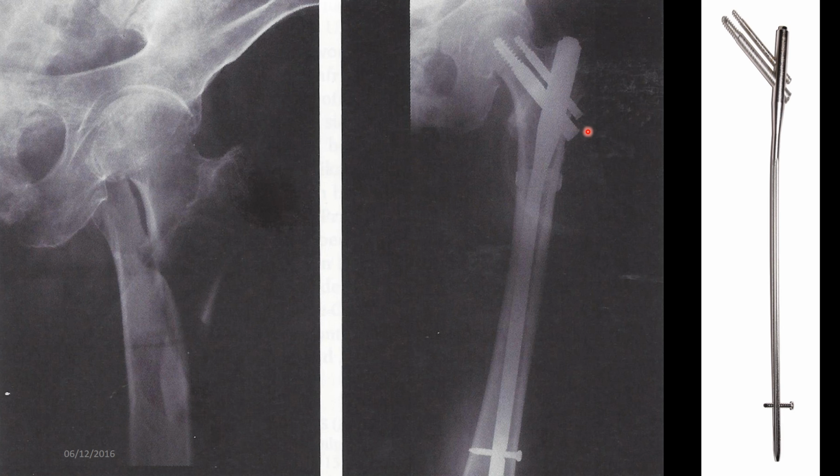It needs to be stabilized properly. And so what they do is something very similar to a DHS, in that they put in 2 screws here, and anti-rotation is what this secondary screw refers to, and it prevents this prosthesis that they put inside from rotating, to make sure that the person walks correctly after the procedure. And so they drill literally all the way down to the bottom of your leg, just above the knee, and then they make a small incision, put this pin in there, and put 2 pins in there, and a metal wire or band that you can see around there to hold this part in place. It all sounds very simple, although this procedure takes about 4 hours, so it's not as simple as what I'm making it sound like in a TLDR situation.